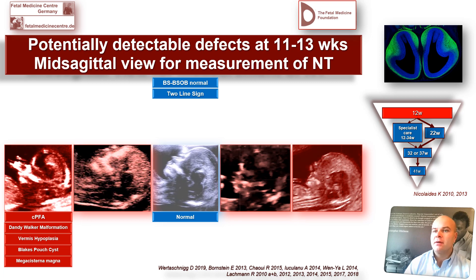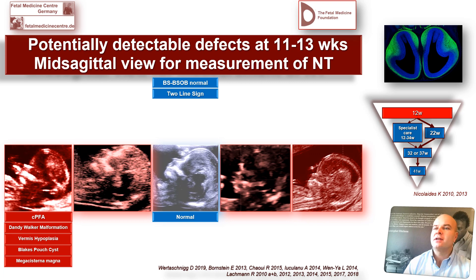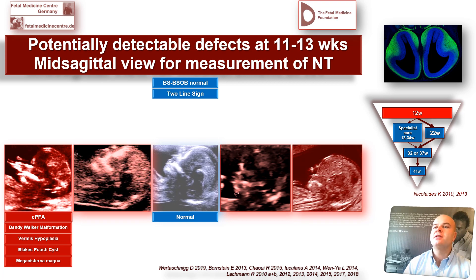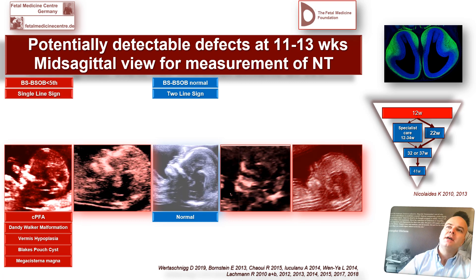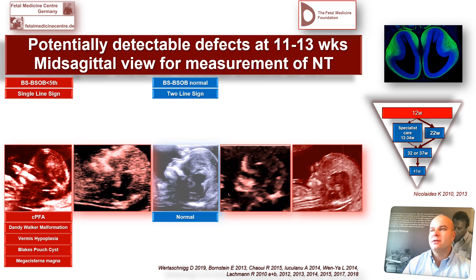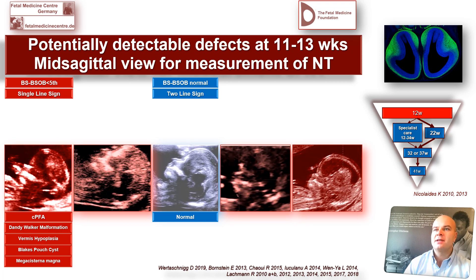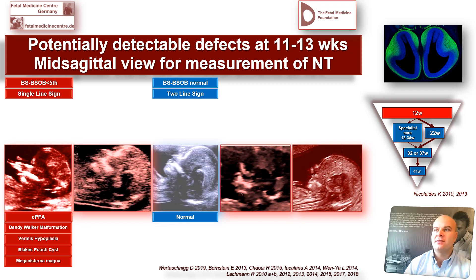We now look at the so-called cystic posterior fossa abnormalities group, which essentially includes Dandy-Walker malformation, vermis hypoplasia or dysplasia, the Blake's pouch cyst, and megacisterna magna. The ratio between the brainstem and the brainstem-to-occipital bone diameter is decreased in those fetuses.